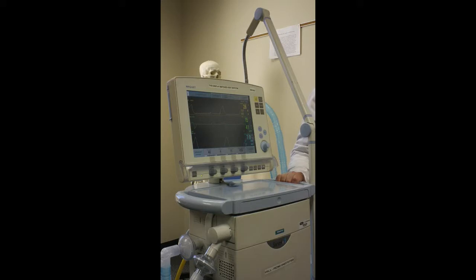And a lot of times there will also be sections on there for, is there an ambu bag with mask in the room? If the patient has a trach, is there an extra trach in the room? Things like that. Your first vent check of the day, you should also be looking for, make sure your ventilator's plugged into the red outlet.